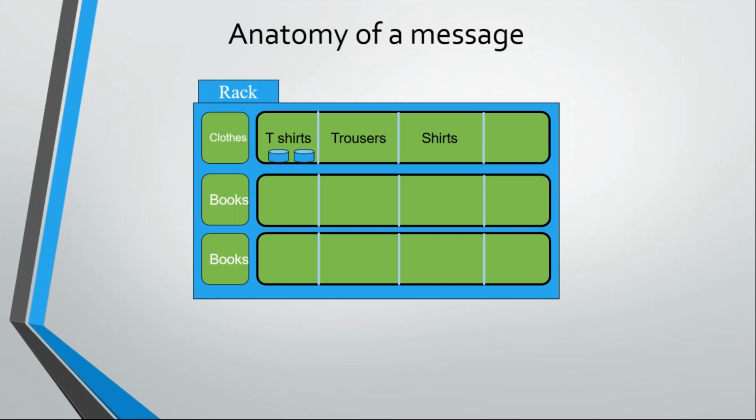When we are capturing data at the front end, we are capturing data elements or data pieces. When we talk about name, name is one data element. When we talk about capturing an email address or phone number, we are capturing those as individual data elements. And these individual data elements have certain specific placeholders in the HL7 message structure.